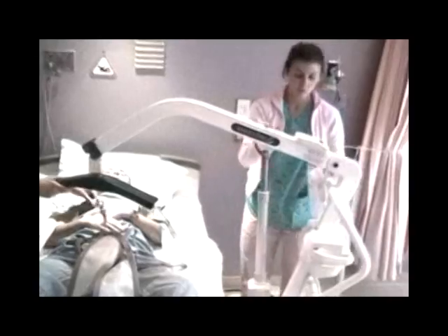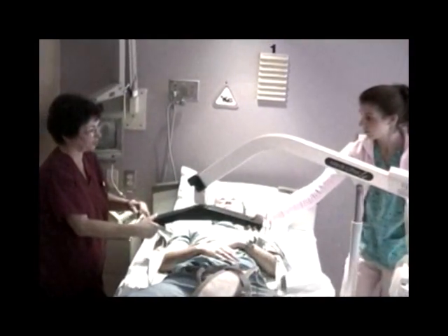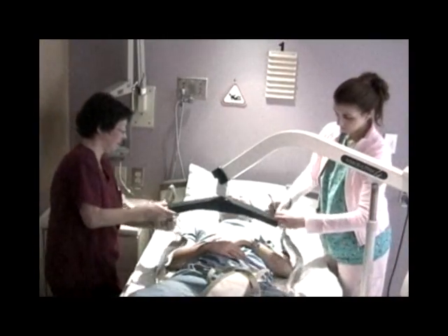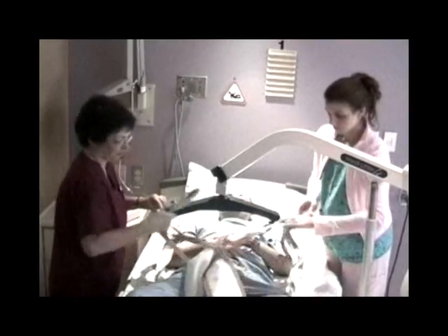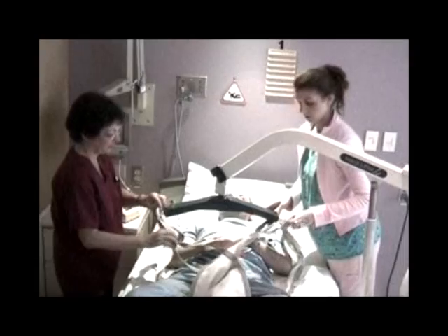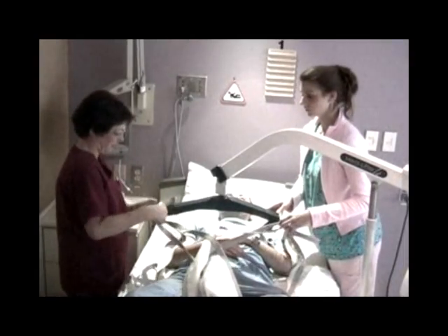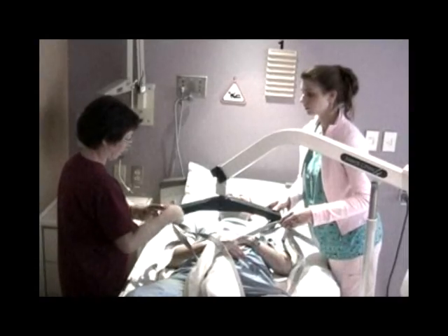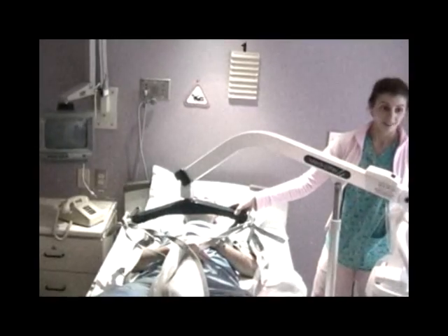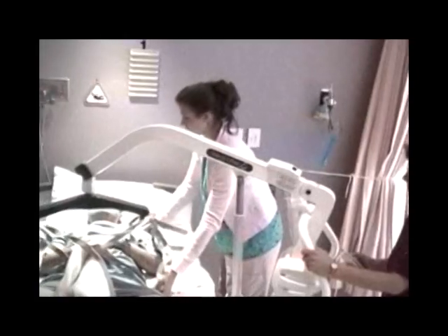Adjust the base of the lift for stability and to accommodate the workspace. One caregiver should remain at the patient's head, and the other should operate the total mechanical lift. Verbally prepare the patient for the move and instruct them to bend their legs. Attach the shoulder straps to the appropriate sling suspension hooks, matching loop size on each strap, and tug on the loops to ensure proper seating. Using the remote hand control on the lift, raise the patient until just clear of the bed.